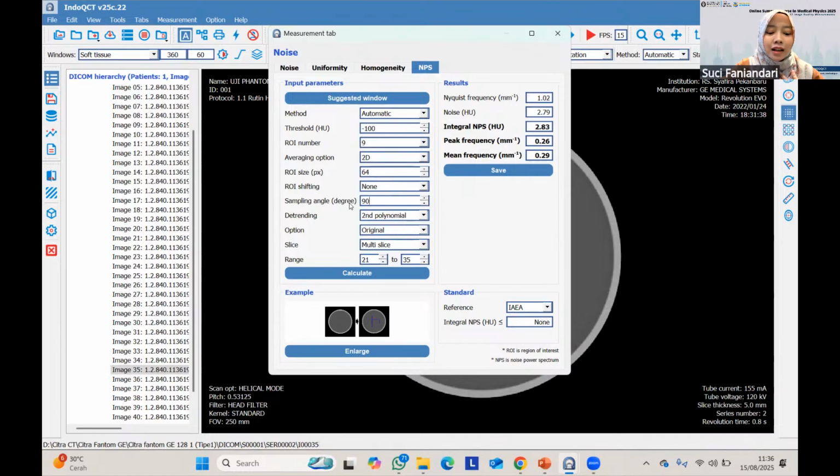I really want to know about the noise level that we have measured by many techniques here. You have mentioned that the noise came from many factors such as quantum noise, image generation, and system limitation. After we measure the noise level, can we analyze which one of those three factors gives the most contribution to the noise level, or is it just the average of those three factors, Doctor?